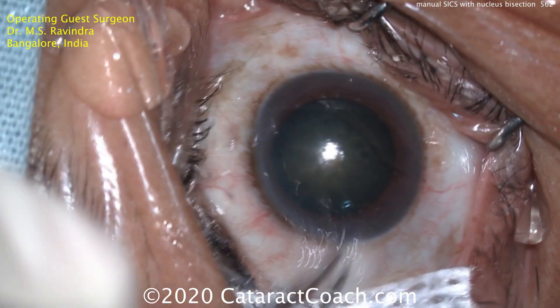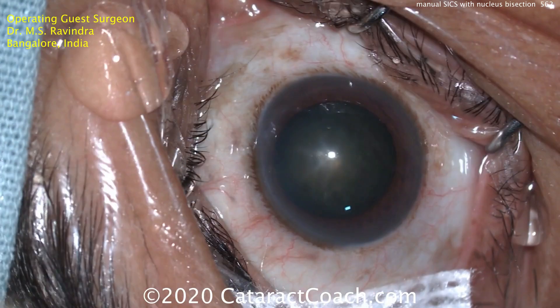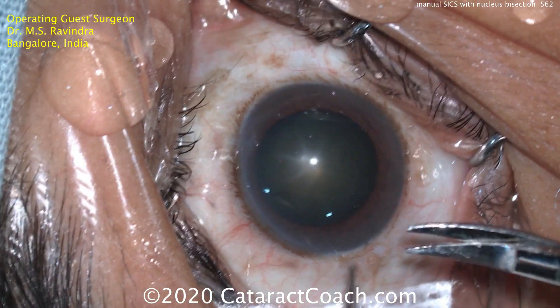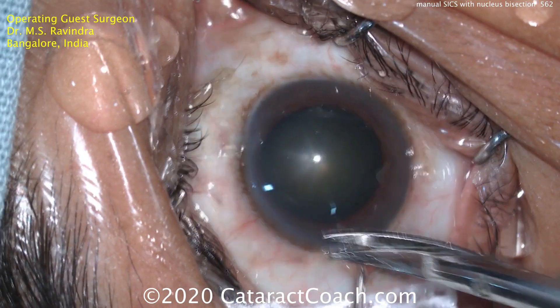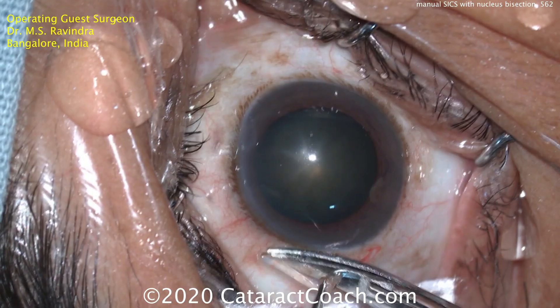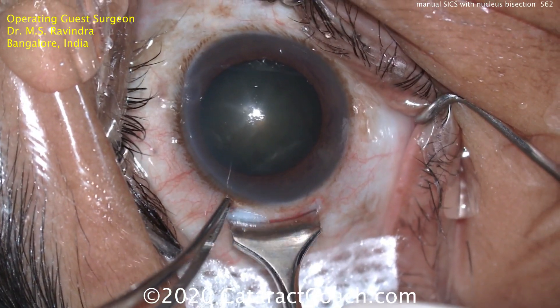Starting off by first putting a pledget with some anesthetic to give good anesthesia so he can do this peritomy — opening up the conjunctiva and Tenon's layer. He's going to aim for an incision size of about 6 millimeters. Here's the marker showing him where to do the incision.